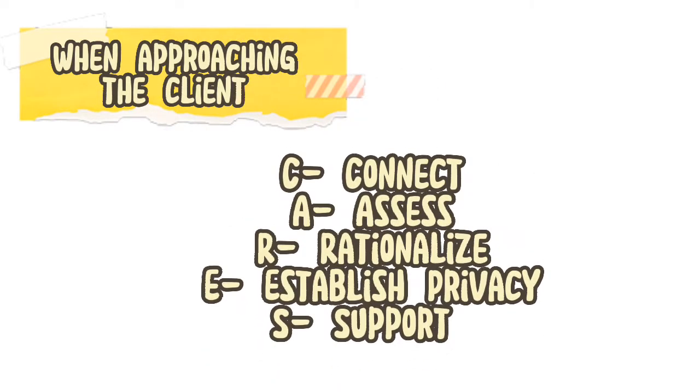When approaching the client, remember the acronym CARES. C. Connect. Introduce self and instructor to client. Identify client. Read wristband and ask client to state his name. A. Assess. Make relevant assessments to ensure that the client still requires the procedure, can tolerate it, and that there are no contraindications. R. Rationalize.